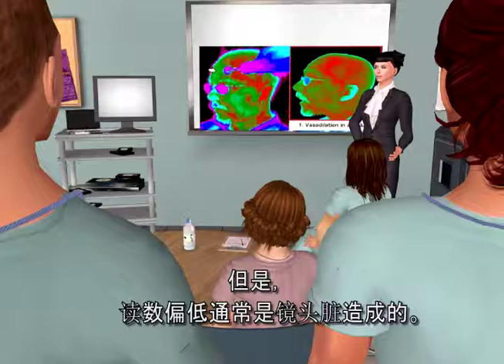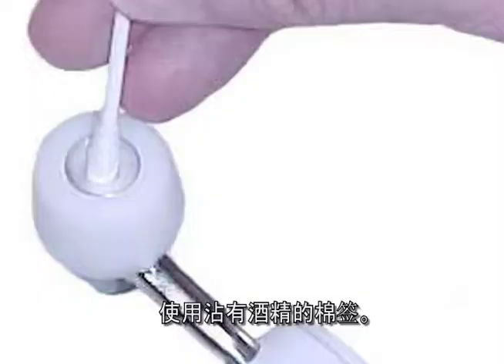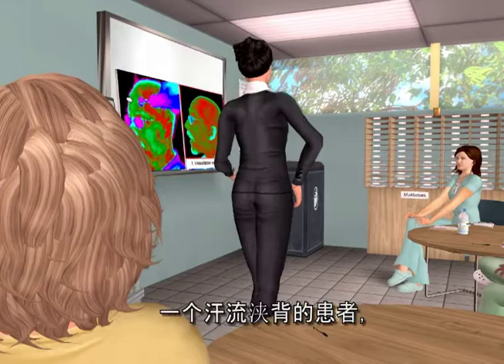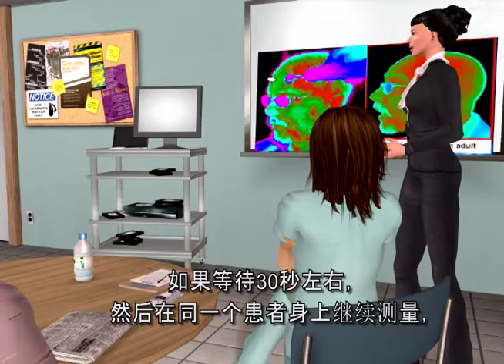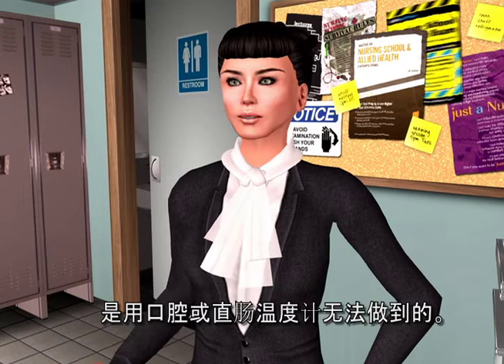Low readings are typically a result of a dirty lens. The lens in the probe tip needs cleaning every two weeks using a Q-tip dampened with an alcohol prep. Other reasons for low readings include curving down the side of the face, a sweaty patient, or taking multiple temps in rapid succession on the same patient. The cold probe is going to cool the skin, and skin is part of the measurement. If you wait about 30 seconds before repeating a temp on the same patient, you'll be fine.